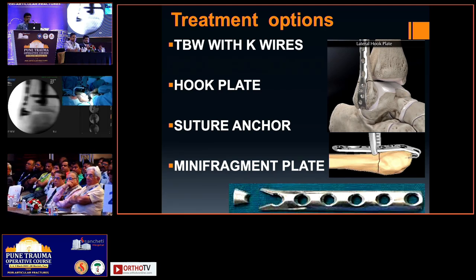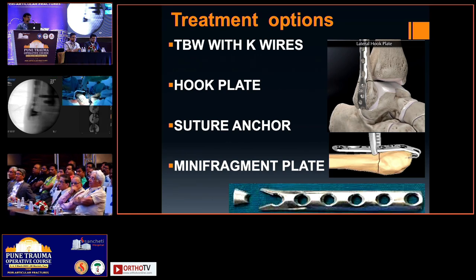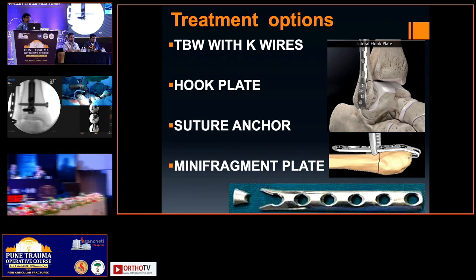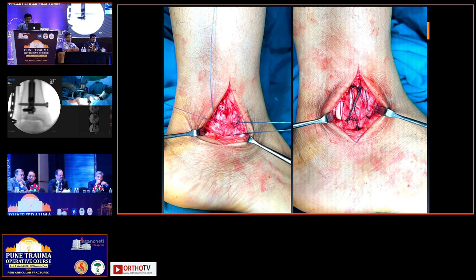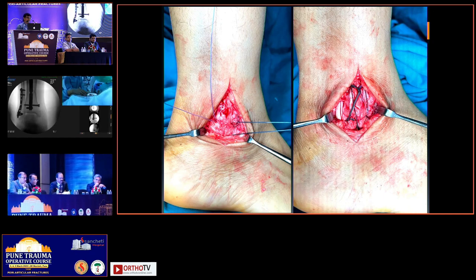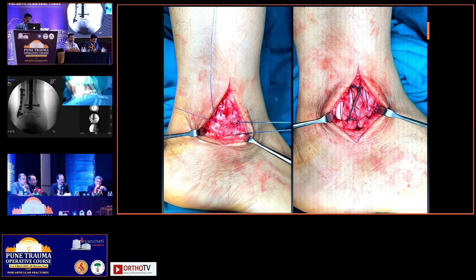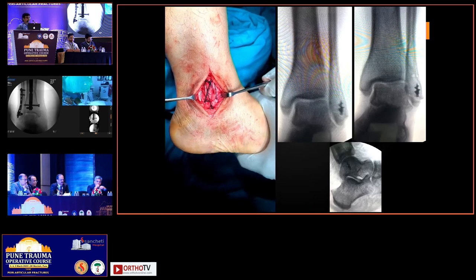Jignesh, what have you done? Yeah. So these were the options. The only thing was the fragment was very small, and fixing with big implants may crack the fracture fragment or crush the fragment. So I used a suture anchor with a fiber wire and tied it up like a tension band with a hole in the fibula and under the calcaneofibular ligament. So I could get good hold of it, and that's the thing on table, perfectly stable.